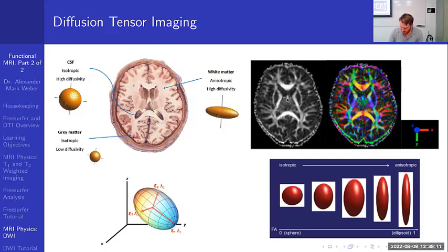So that's here in black and white, where fractional anisotropy is an index for the amount of diffusion asymmetry within a voxel defined in terms of its eigenvalues. So the value of FA varies between 0 and 1, so it can't be lower than 0 or higher than 1. For perfect isotropic diffusion, so that's like a sphere where water doesn't have a specific direction, FA is going to be 0. With progressive diffusion anisotropy, kind of down here, the eigenvalues become more unequal, the ellipsoid becomes more elongated, and the FA goes towards 1.